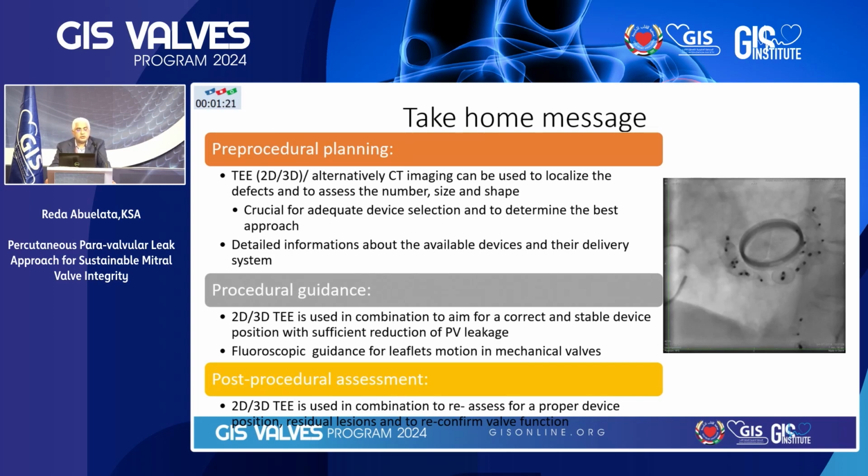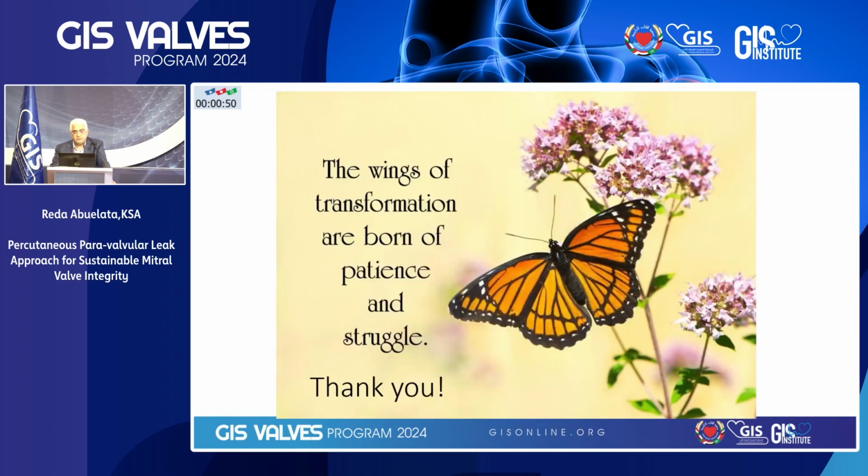Fluoroscopic guiding of the leaflet motion is another priceless way of assessing the safety of the patients, so that by the end of the procedure you have not unfortunately impaired one of the two leaflets, ending up with another major complication. The post-procedure assessment, again, is 2D and 3D assessment in combination to reassess for proper device position, residual lesions, and touching again the endpoint of the procedure.